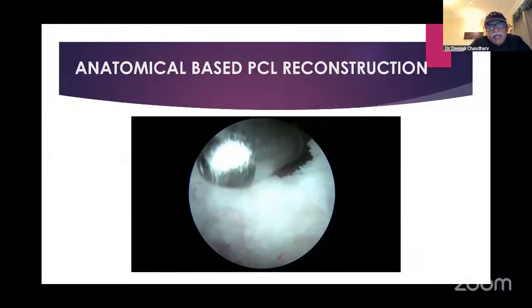Perfect. So, I follow a chronology or steps, each step every time the same. Two windows are very important. That is the window of the septum that enters the medial compartment. And then you have a second window between the MFC and the PCL remnant. You take the posteromedial portal, which is slightly higher, onto the synovial fold. It consistently should be there. So it gives you an over-the-top position to pass your switching stick. Once you do that, you keep your scope near the septum and see that the switching stick is entering the hole which you have created in the septum.